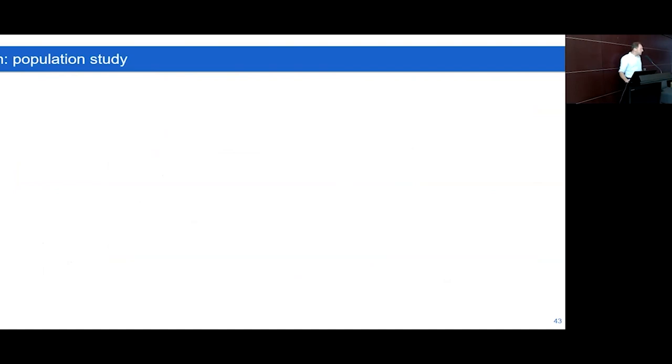We did a population study in order to know how the decline was in PEth. So if I would monitor each one of you, and I would have your insight in your PEth level today, and then you would remain abstinent for a couple of weeks, then I can predict where you'll be in a couple of weeks. And this is relevant because some people present with a relatively high level and remain abstinent, and then will still be positive for this PEth marker.